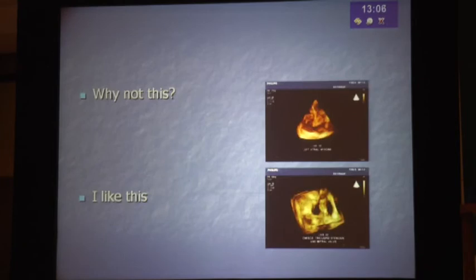Again, this is a 3D echo with a large myxoma. This is a mitral stenosis from a large left atrial myxoma. These things can be easily picked up on 2D echo. They, however, look much nicer on 3D. But like I said, if you want to invest, invest in the 2D echo, unless you're in a big corporate setup where the corporate organization buys it for you.